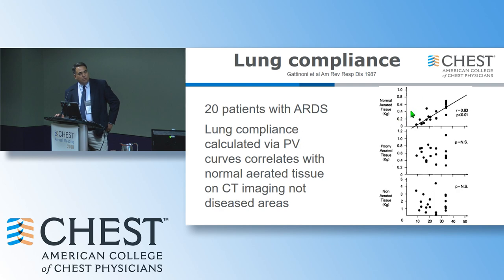So when you plot the normal aerated tissue on the y-axis, you can see there's a very tight correlation with the lung compliance, but not so much with the areas of the atelectatic or poorly aerated lung.